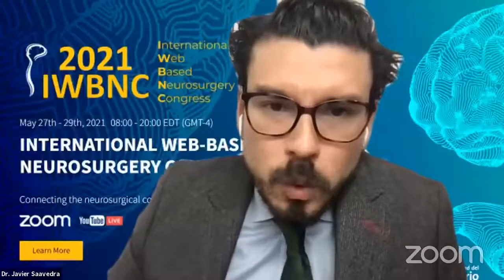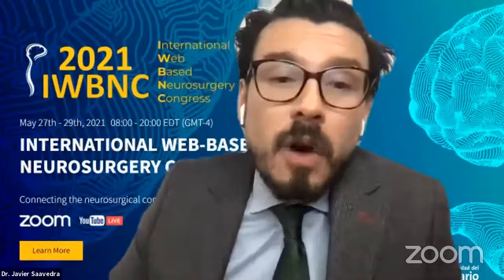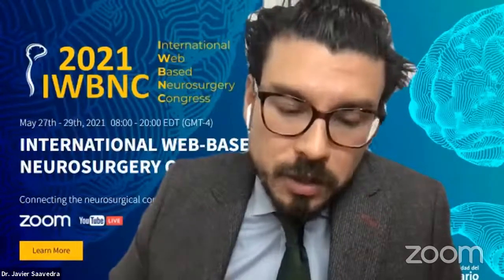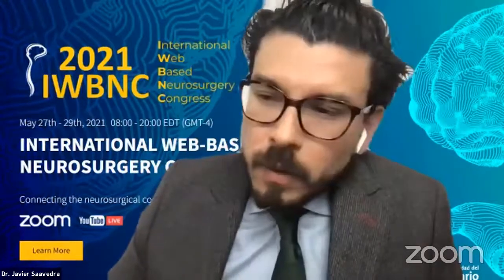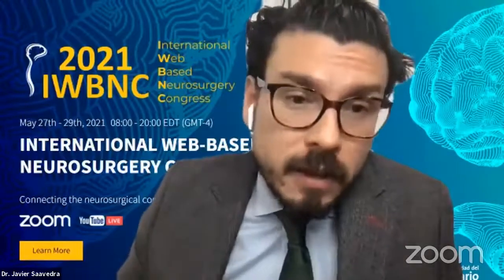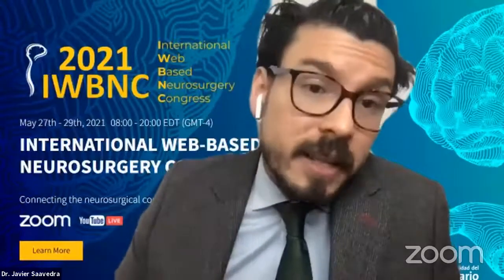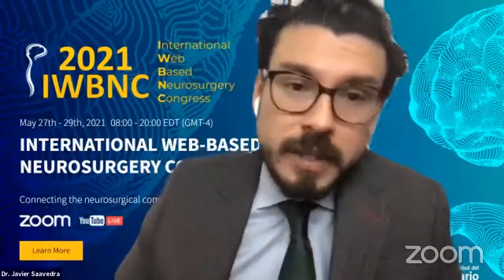Yeah, the first question. What we do is release the retraction every 10 minutes. There's no paper saying how long we can have retraction. I mean, we don't know what the reason would be, or if the intraocular pressure actually rises during the procedure. We don't know. But we think it could be elevating the intraocular pressure, so we just release the retraction every 10 minutes.